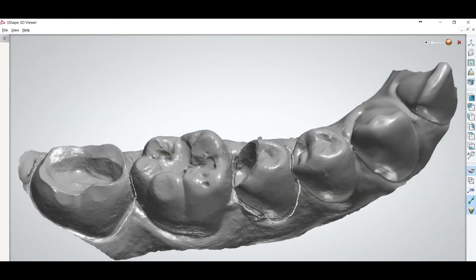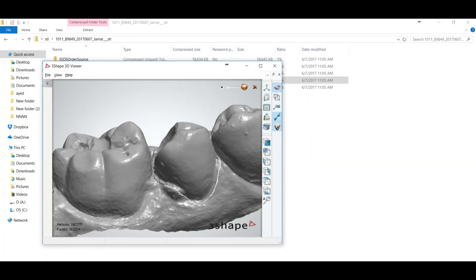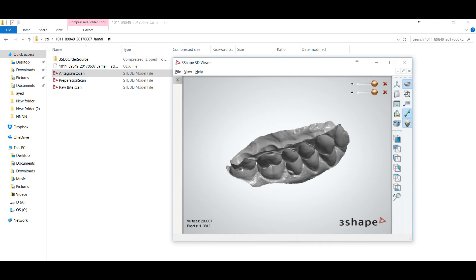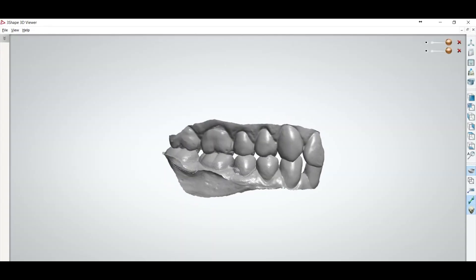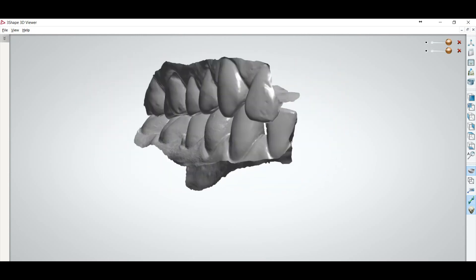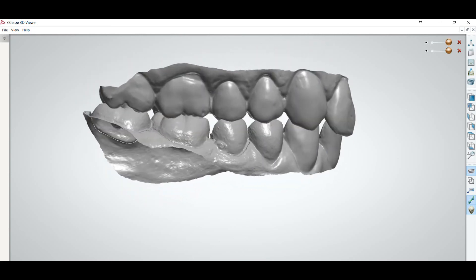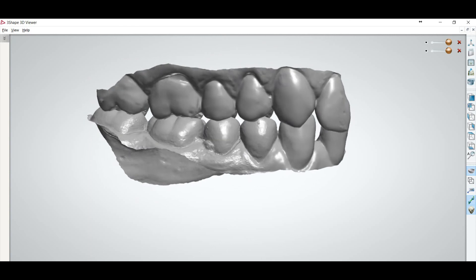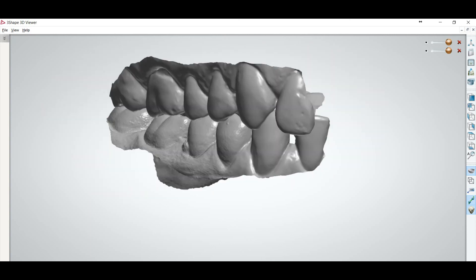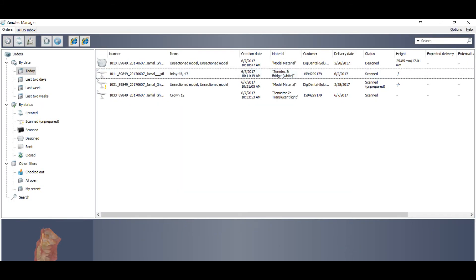You can also check your antagonist and your preparation. You will observe they are in the same bite and same position as the doctor has sent you. This is another way to convert your DCM files into STL.